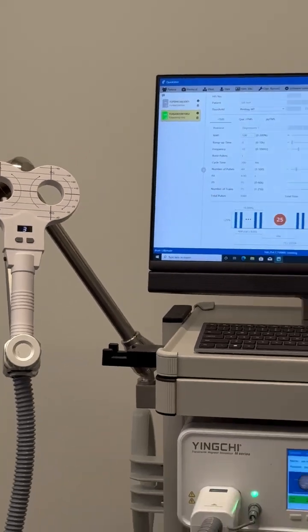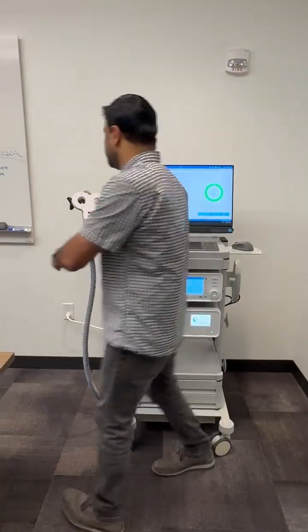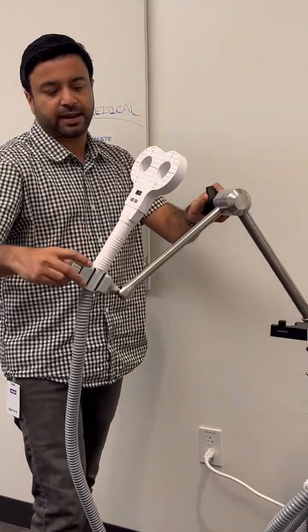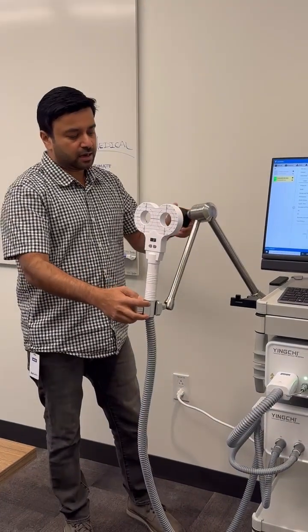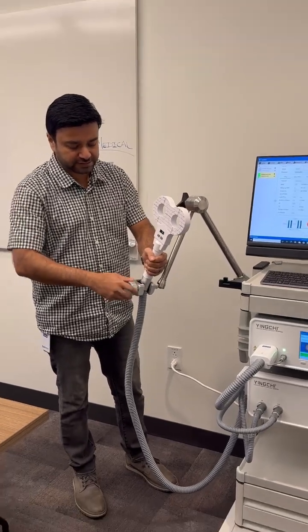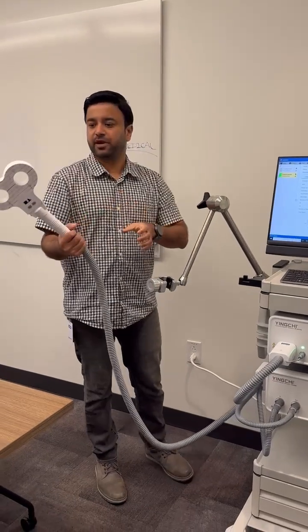I'm going to pause for now, but let me bring your attention to the coil. You have a very flexible coil arm support that is connected to the cart, and you can have your patient chair right next to this setup. It moves in all three directions, and the coil itself is much lighter. If you decide to do this by holding it in your hand, it's pretty easy.